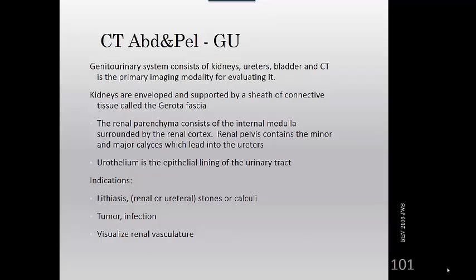Urothelium is the epithelial lining of the urinary tract. And some common indications for CT of the urinary tract include the identification of urinary calculi, or lithiasis, as it's called. These are stones, renal stones, or ureteral stones. Another indication is evaluation for tumors or infection. And then also we want to visualize and assess the renal vasculature.